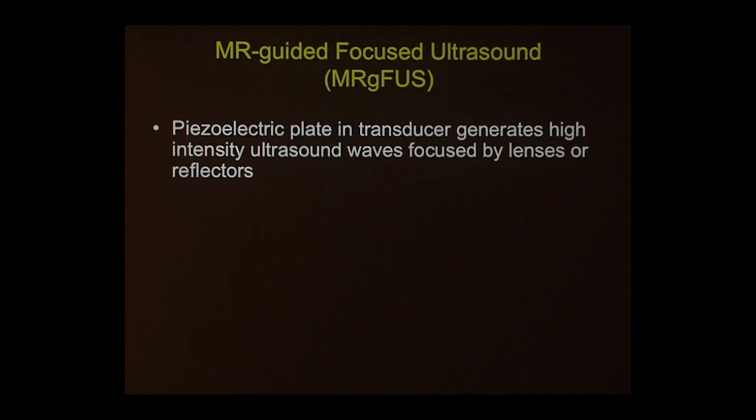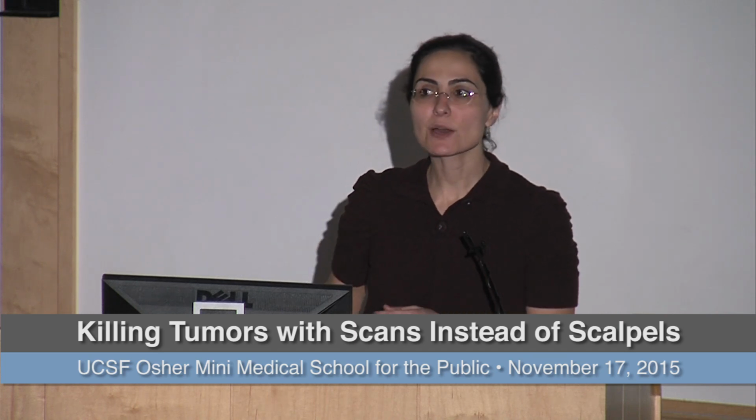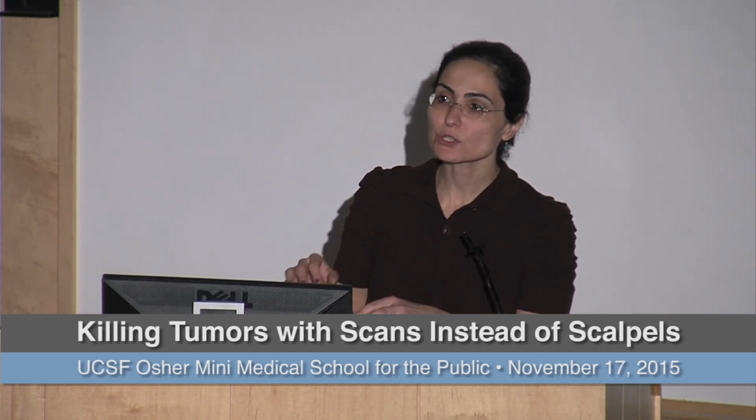Now, MR-guided focused ultrasound, we talked a lot about, Dr. Bucknor talked a lot about this, so I'll just quickly go through it again. Basically, what you're dealing with is an ultrasound. How many of you have had ultrasounds in your life, right? More women, clearly. But the ultrasound sound waves that were emitted into your skin were very low in energy. So they went in, they saw the tissue, and came back and gave us information on the images.